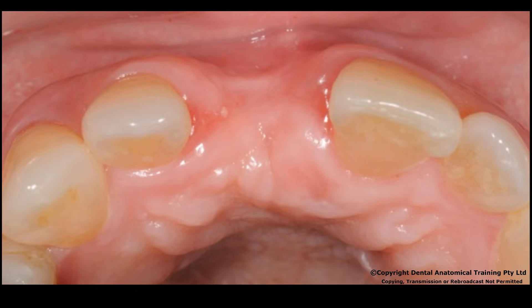Compromise of the bony anatomy, as seen here in the aesthetic zone of the anterior maxilla, can significantly compromise the aesthetic outcome of prosthetic replacement of missing dentition — both in quantity of bone available for implant-supported restoration and also the contour for the aesthetic outcome.